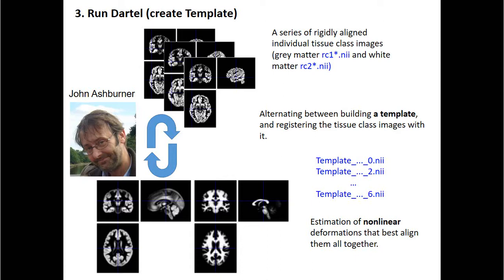When you want to estimate the thickness of the gray matter in a group of subjects that has dementia, or you want to be able to compare a control group, I guess this is also a good reason to use a template and to have a reference. No? The template doesn't give you an idea of how normal or not normal your segment is at the level of segmentation. But then this is your reference from which you will be able to compare two groups, right?